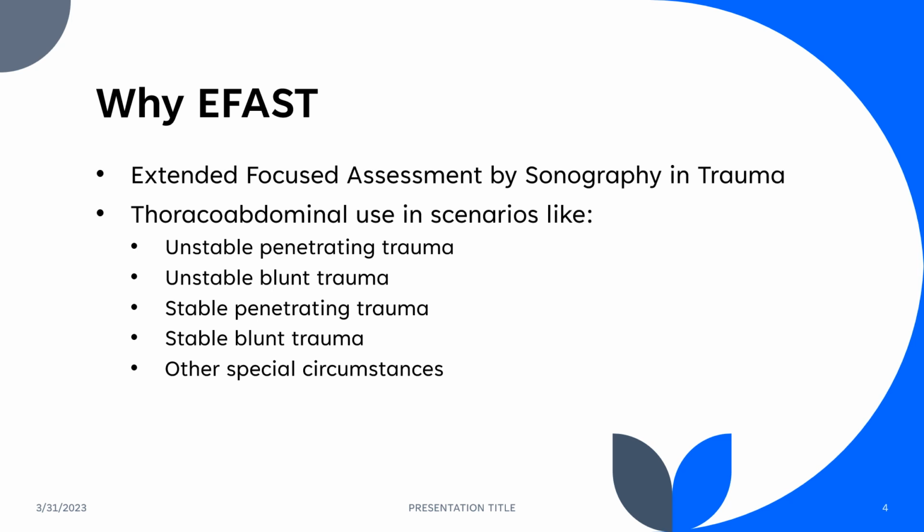So at that point, they changed what we formerly knew as the FAST exam to an extended FAST, or extended focused assessment by sonography in trauma. There are many different reasons that you can use this, but we're typically utilizing EFAST exams to do a very fast examination of the thoracoabdominal cavities in patients that have stable or unstable penetrating trauma, as well as stable or unstable blunt trauma.